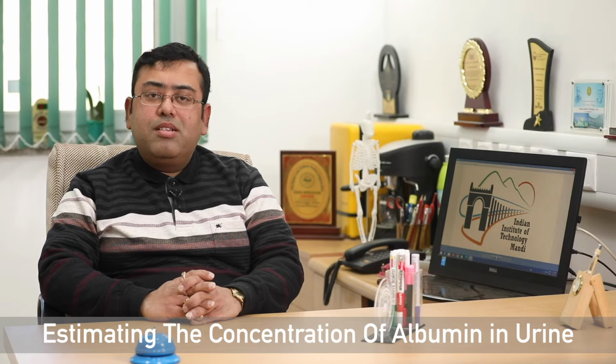This is Dr. Shubhajit Roy Choudhury. I am an associate professor at the School of Computing and Electrical Engineering, IIT Mandi. I work in the area of non-invasive diagnostic systems for the point of care testing of patients. Here we are developing the prototype of a non-invasive diagnostic system that can estimate the concentration of albumin in urine.